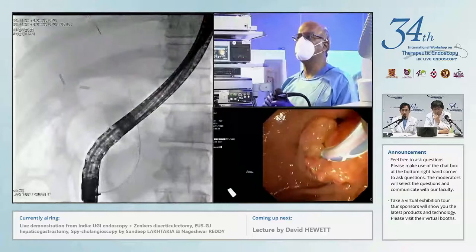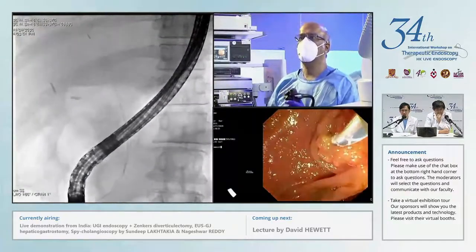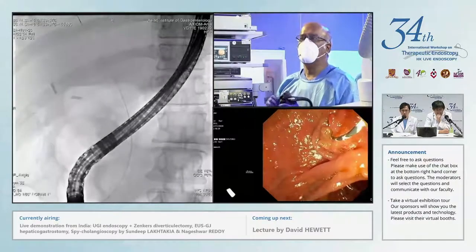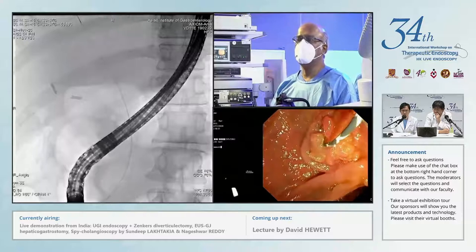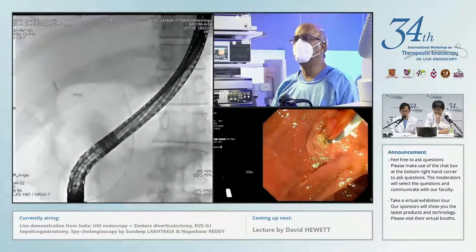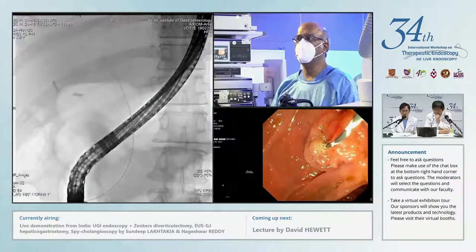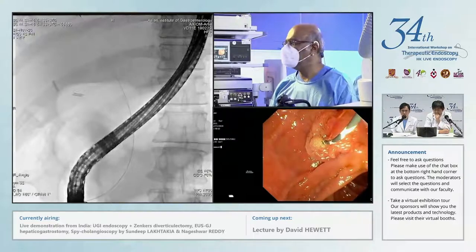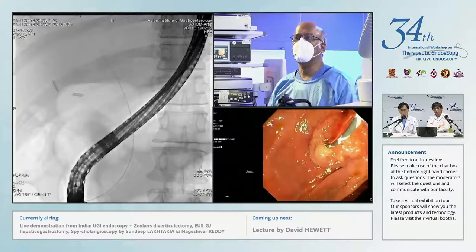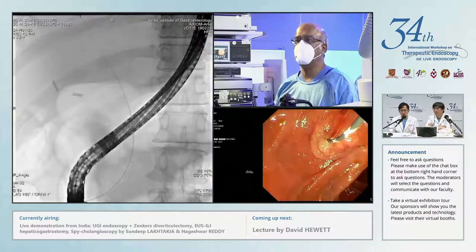Raymond, you can see the fluoroscopy? Yes, we got a good view there. So what I'll do is I'll now remove the sphincterotome. Again, you don't inject any contrast when you're thinking of cholangioscopy, mainly because the view gets a little obscured and you get an oily view when you have contrast. So what we plan in this case is to use a cholangioscope directly on this guide wire. And once we are reasonably high up, we can remove the guide wire and then follow the cholangioscope down.